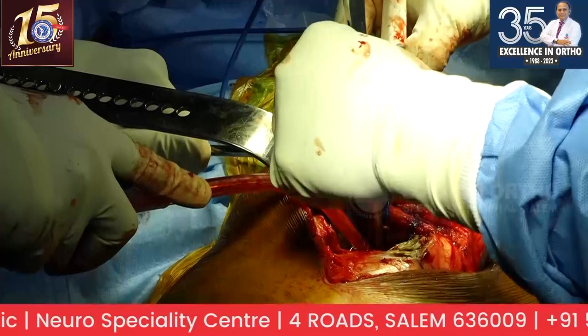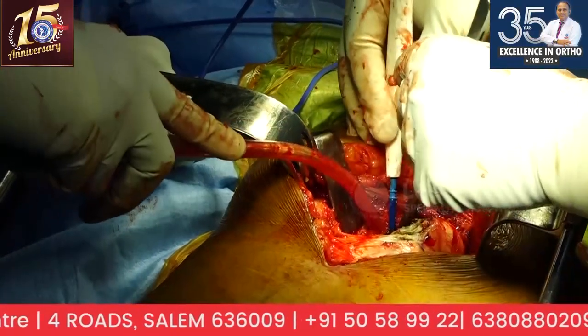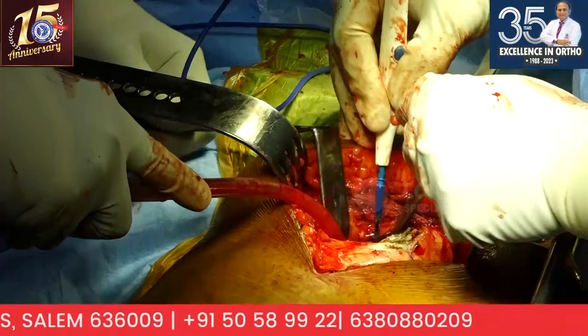Is this your routine approach for all hips? Yes, this is my routine approach for all my hips. Including hemiarthroplasty? Including hemiarthroplasty. Good.